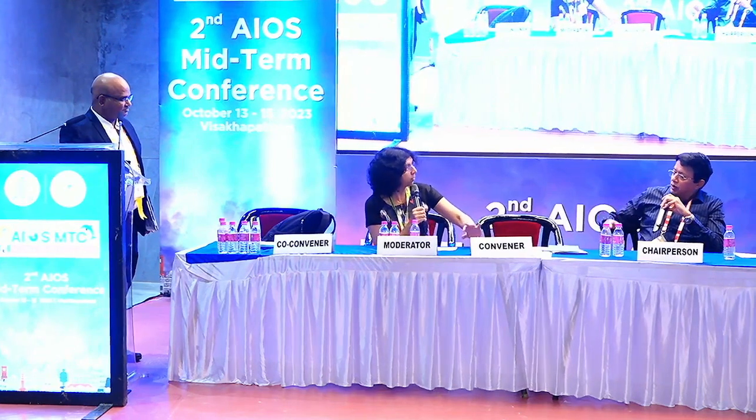No, very rarely you come across situations like this. But the company nomogram takes care of all this, not just the white-to-white, but the AC depth as well as the keratometry readings. I think the issues that we normally have are if you have, say, a white-to-white which is 11.6, 11.7, or 12.6, 12.7. There it could go either way, just a 0.1, 0.2, this way, that way. Then if you take, say, a 13.2 for a 12.6, that could be flat. And if you take 13.7, that could be a high vault. So that's where you have this dilemma, and then you have a discussion with them, and then you toss a coin and decide, let's go with one.